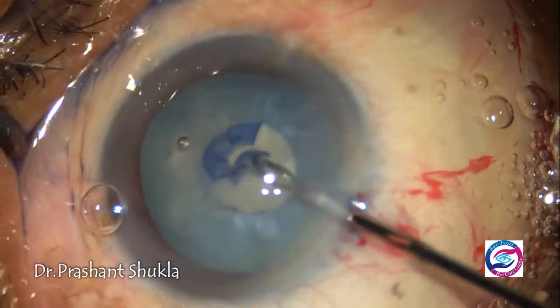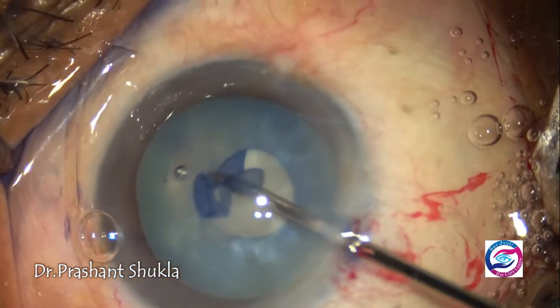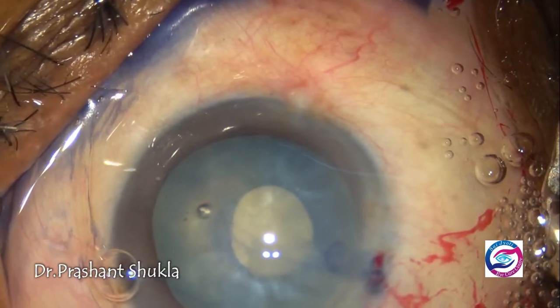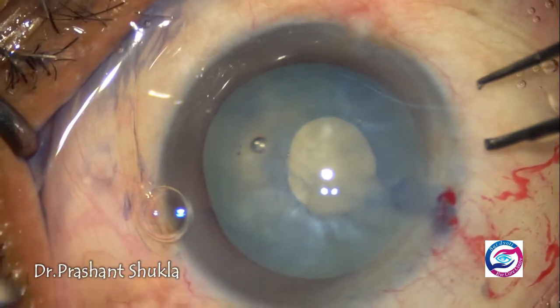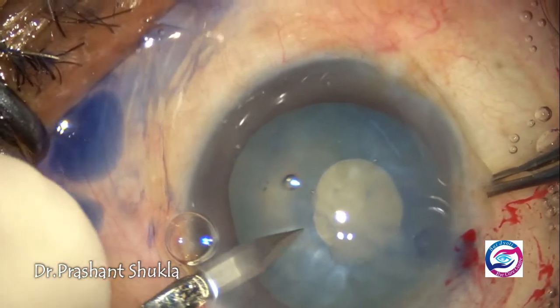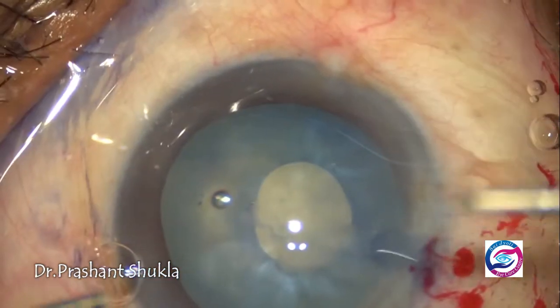Here I have completed the initial small Rhexis. Although eccentric, now is the time to decompress the bag. I shall be using a bimanual irrigation aspiration, and for that I have made one more side port.